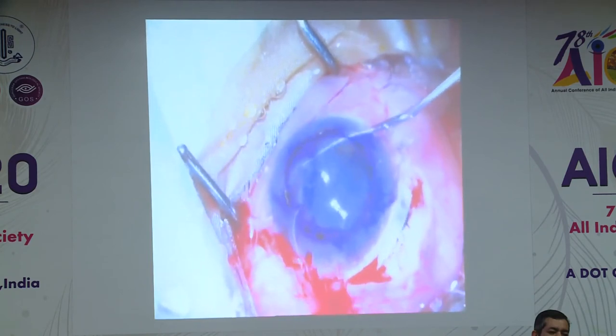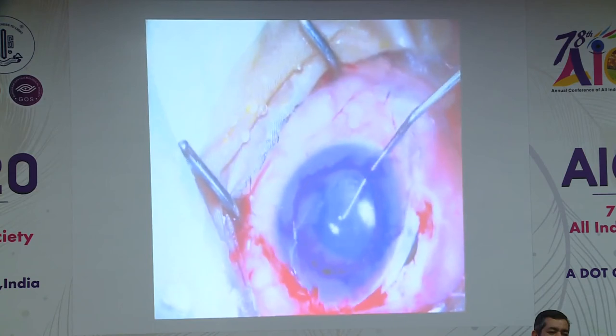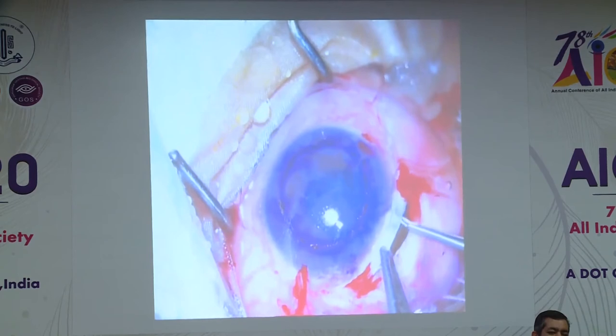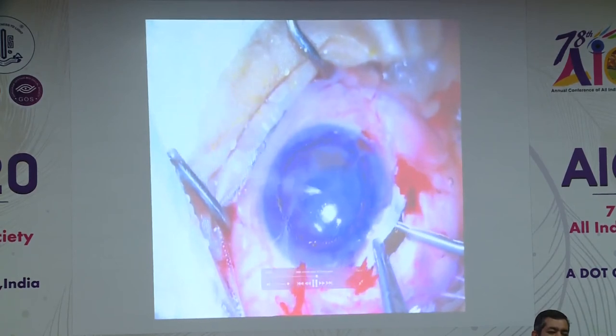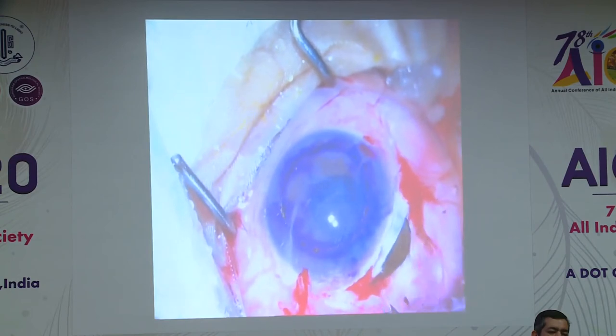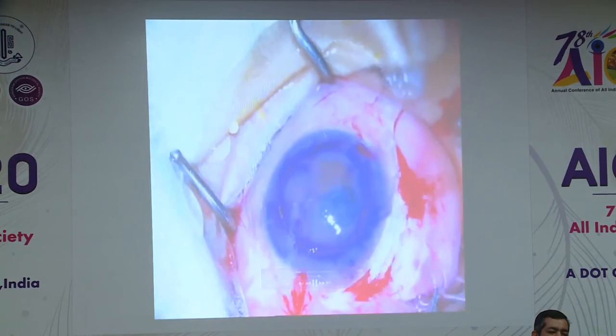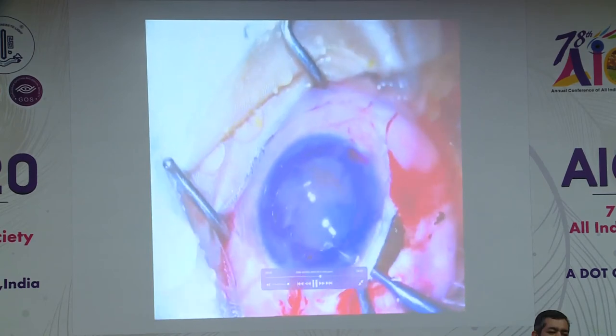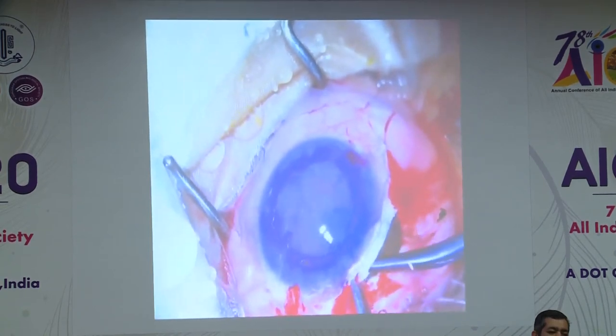after I got the IOL into the AC, I did a Descemet's scoring. Again, the Descemet's, you can see, this is not normally the way I do this, but it was very scarred. There was a premature entry. I had gone superiorly in this patient. I removed the original IOL from this patient. And though there was no vitreous, I then put a retrofixated IOL in this patient.